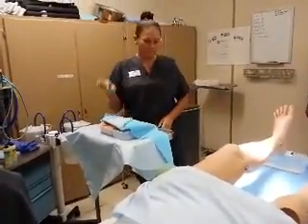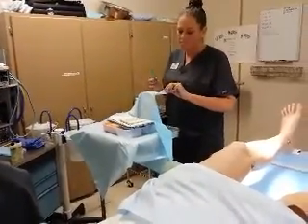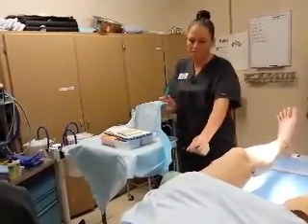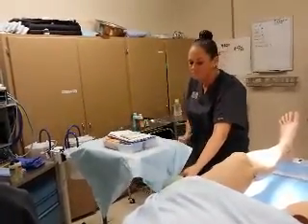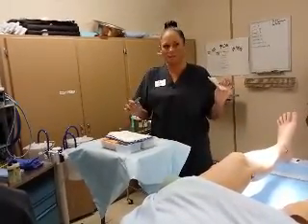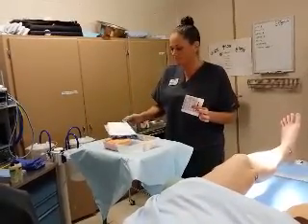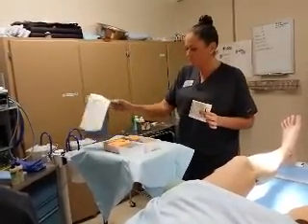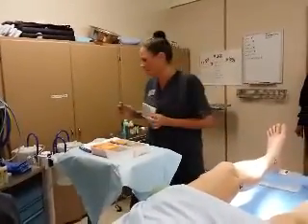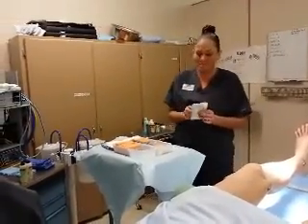Tweezers right here. You can use two hands as long as you don't contaminate, if that's flipping over. Grab my gloves. Do I want to set this on? Oh, I'm not supposed to tell you that. That's right. Sorry, I'm so used to showing common mistakes.